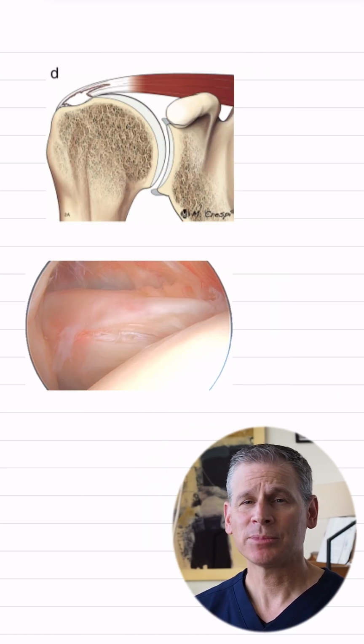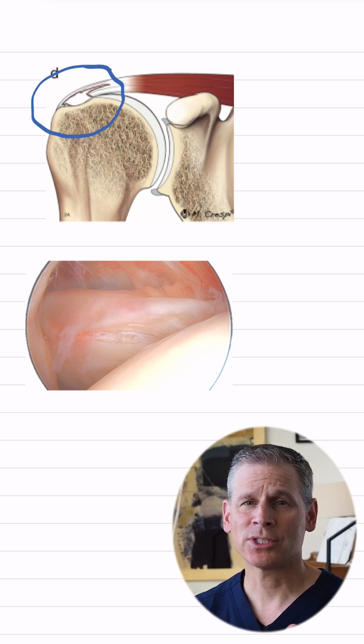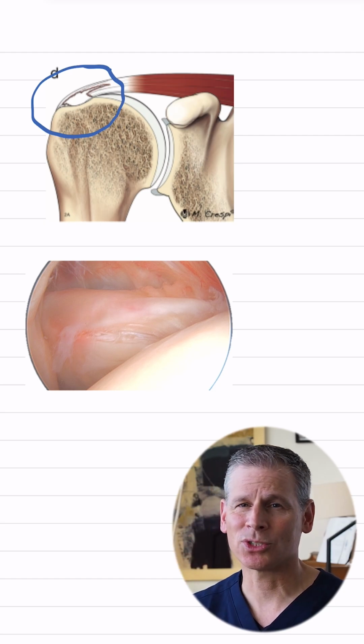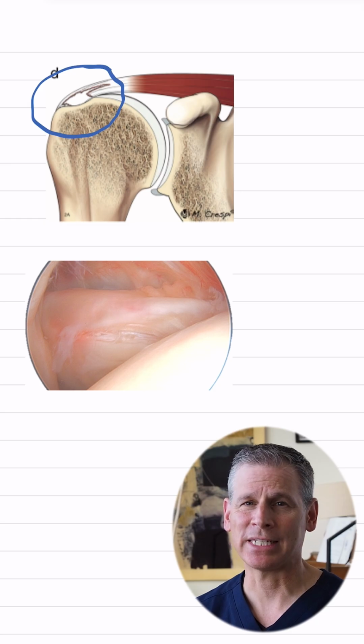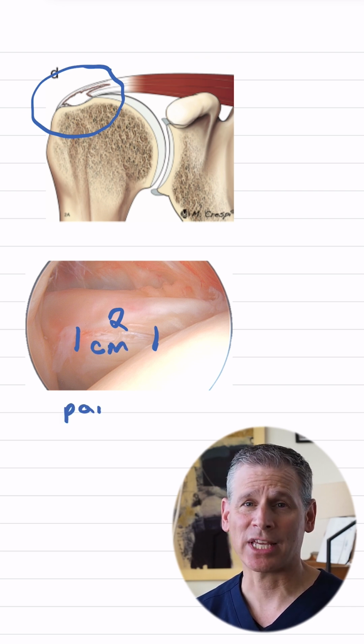And sometimes you might have a partial tear where just a few of the fibers are scuffed up and worn, and you might have a partial tear where it's just barely hanging on by a shoelace. So it really is important to look at the images and find out what kind of tear that is, rather than just looking at the description, because the description can sometimes be a little misleading. And I will let you know what my interpretation of the partial tear or the full tear is, and send you a message over my chart so you'll understand that better.